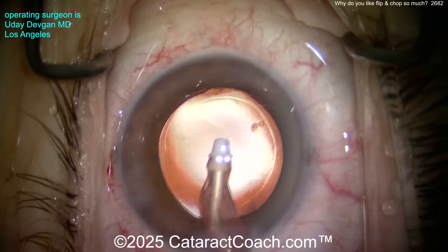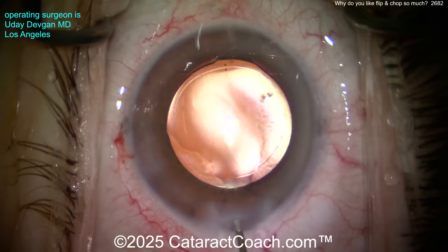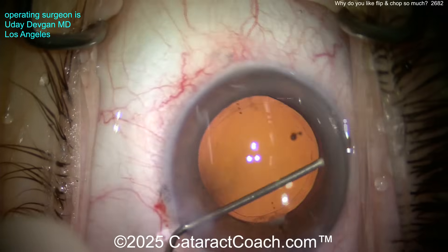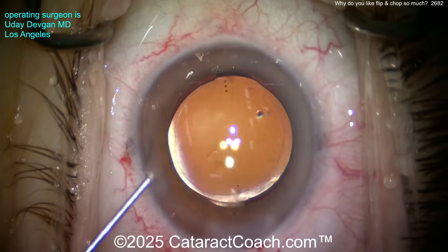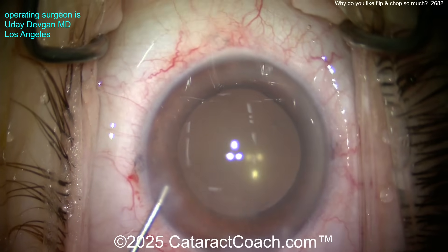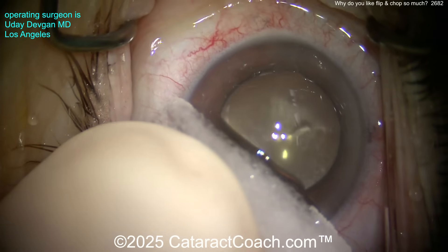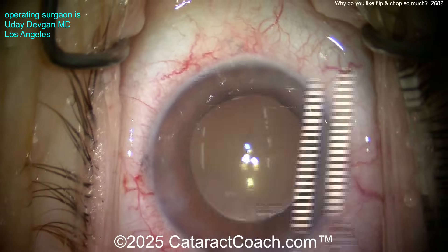Beautiful case. I like to do flip and chop, but not for every case — if I do 20 cases, maybe half or fewer would be flip and chop. If there's a lot more nuclear density I'll do something different. If it's a smaller eye or shallow anterior chamber, you're going to have a tougher time with this. Sometimes you'll intentionally make a smaller rhexis — for example, if you're combining with a glaucoma procedure or the patient is going to have a trabeculectomy soon after, you want a smaller rhexis to trap the IOL optic in the capsular bag, so that a flattening AC or vitreous pressure from an air bubble won't rock the lens out of position. There's some triamcinolone — a little goes a long way to reduce inflammation in the first couple of days. Here's a small aliquot of preservative-free moxifloxacin. Squirt the rest on the cornea, get the pressure where you like it. Now check the incisions to make sure they're completely sealed. That was just some tetracaine, which is hypotonic and causes a little focal osmosis — and that looks just fantastic.